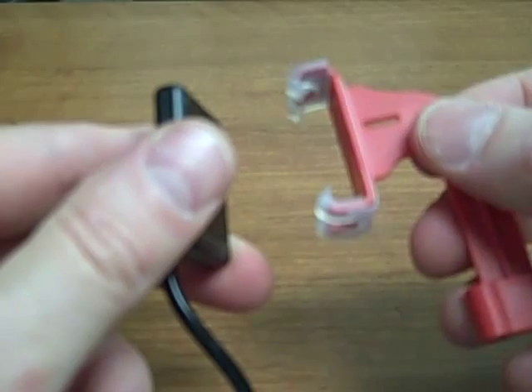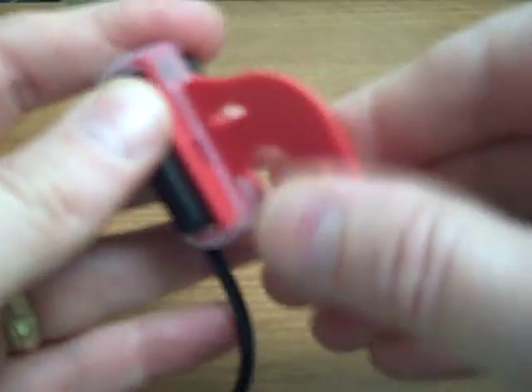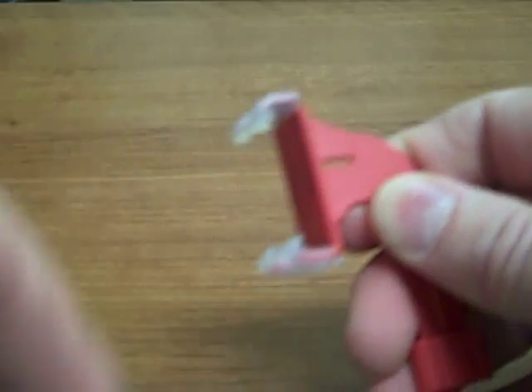The XCPD-SFIT Universal System has custom bite blocks for each indication. Here's a horizontal bite wing — you can see how that's loaded. There's no tension on the cord, and you have nice soft silicone that's not going to perforate your barrier.